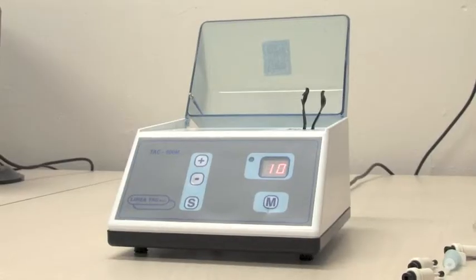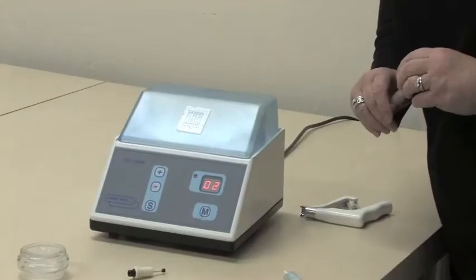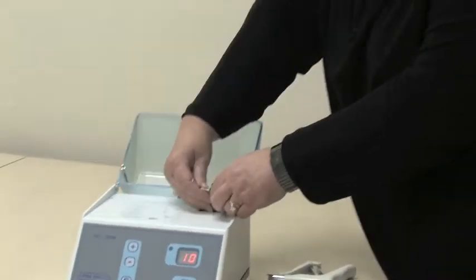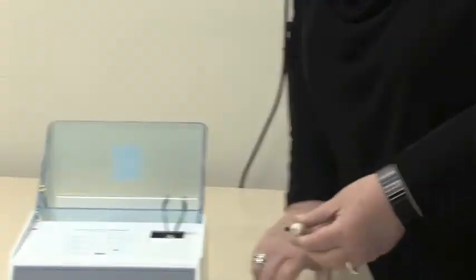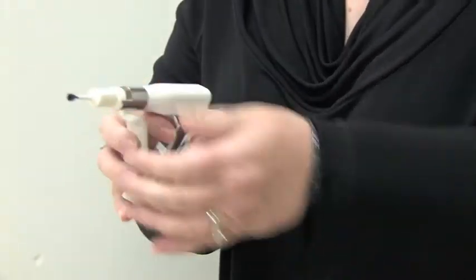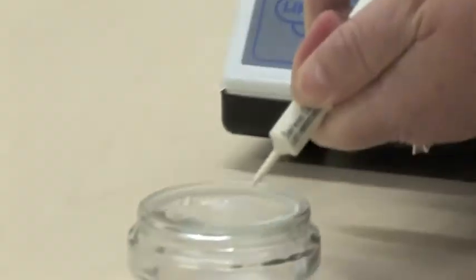We then put it onto the machine in exactly the same way as before and you shake it for 10 seconds. When it's been shaken for 10 seconds you take it out of the mixer, you pop it into the applicator, you pull off the end plunger and express it in exactly the same way.